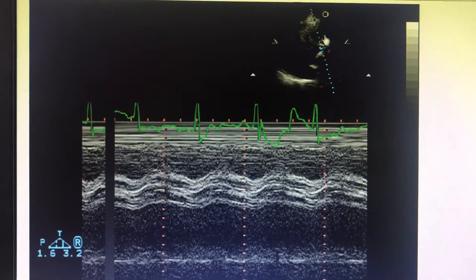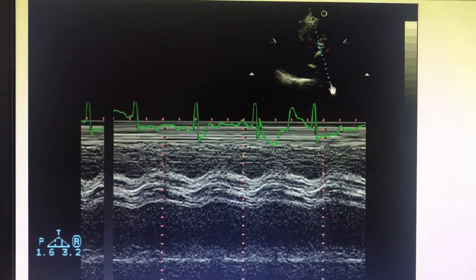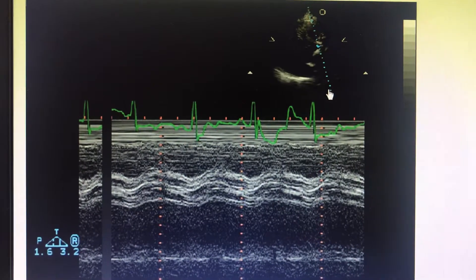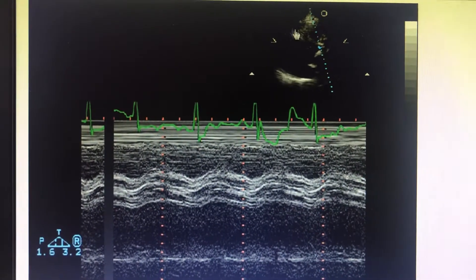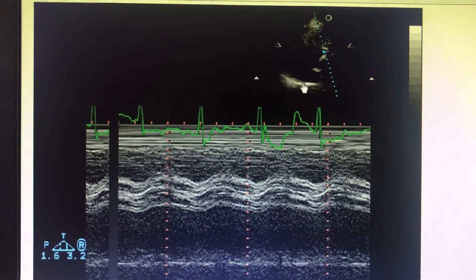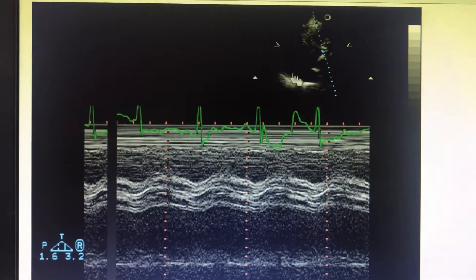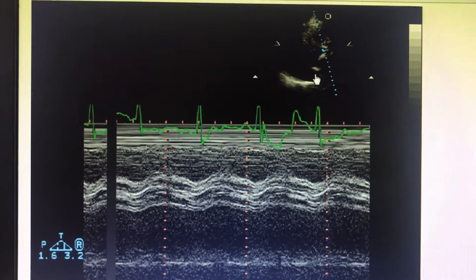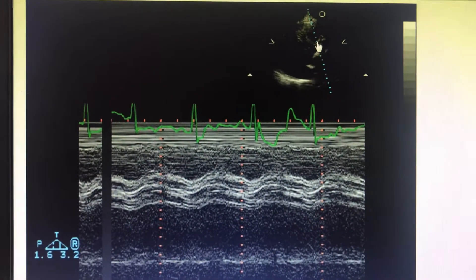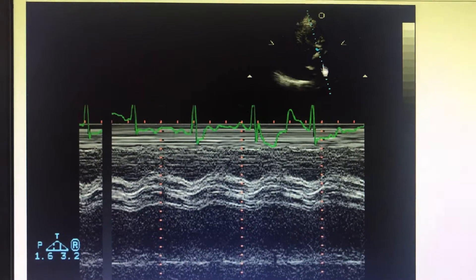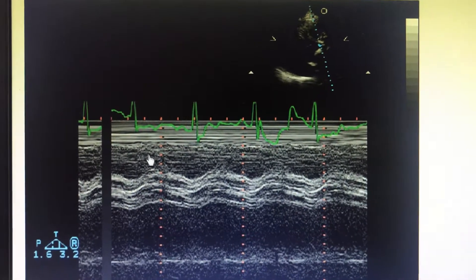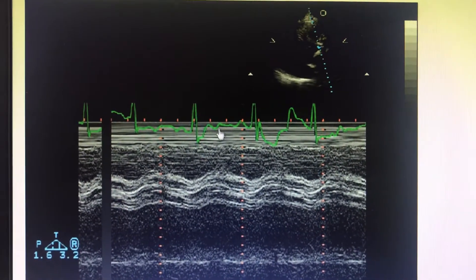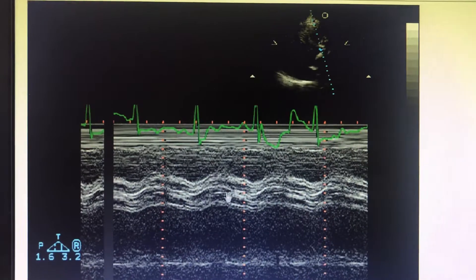Here the M-Mode cursor is across the aortic valve area. This is the LV, this is the parasternal axis, the LV is seen, the mitral valve is getting opened, the aortic valve is getting opened, and the aorta. The ECG correlation is there to help identify the cardiac cycle.